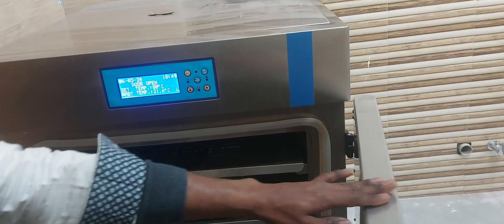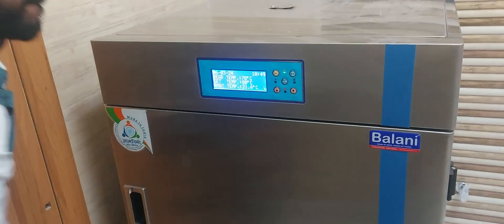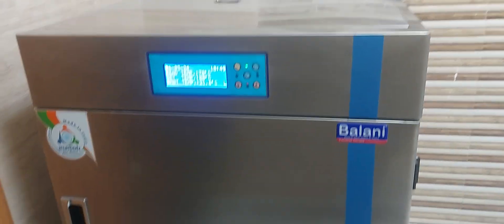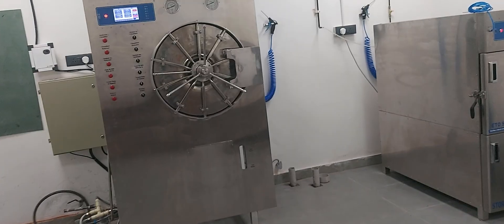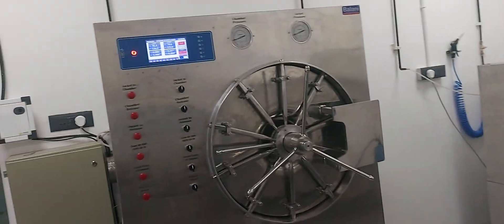ETO is the process where we have to complete sterilization. So first you put items here for the sterilization, and then they go into the section for different sterilization technologies. This is our ETO sterilizer, and this is our steam sterilizer.